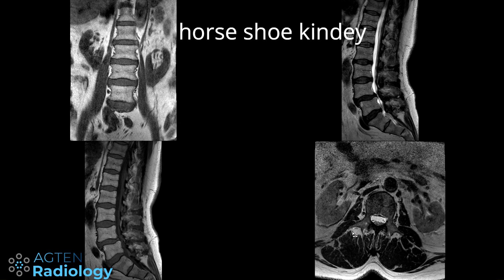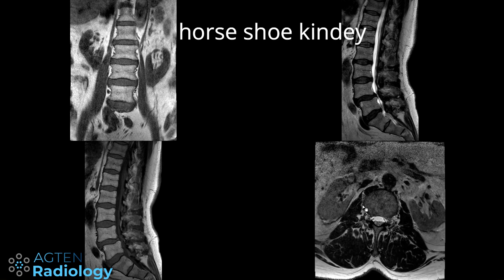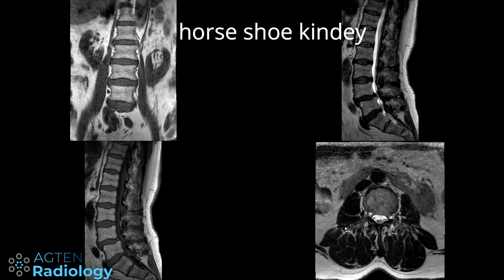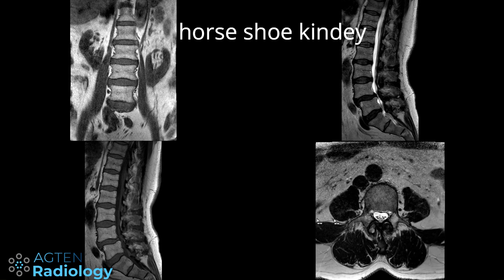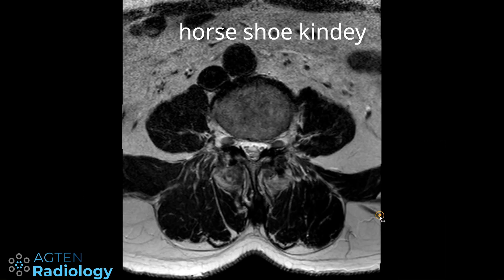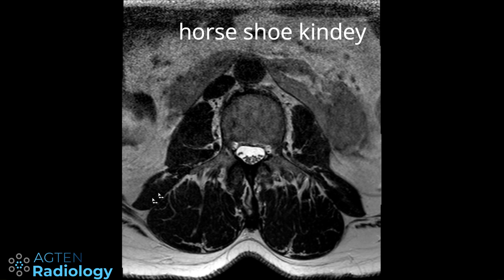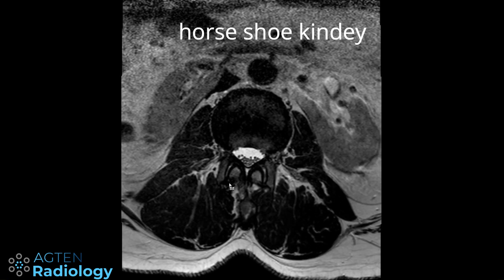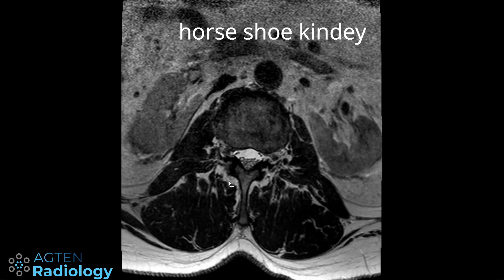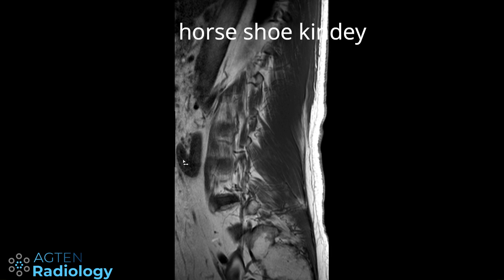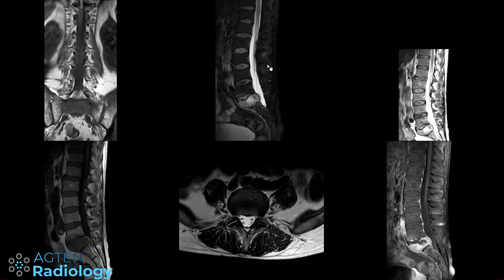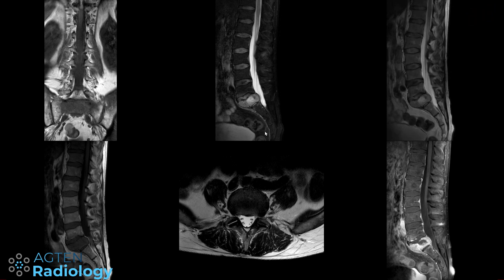If you just look at this image and focus on your spinal canal, you might actually miss this finding — but it's actually a horseshoe kidney. In this particular case it was mentioned in the report, as you can see here. A very subtle finding. It's a nice case, unfortunately for the patient, to show you incidental findings.